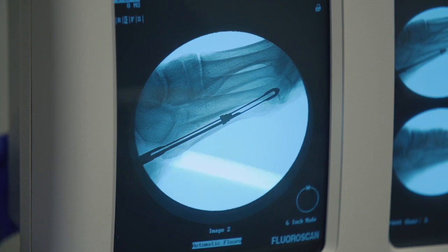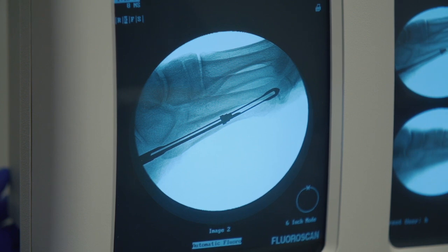Here, utilizing the new targeting guide through Stryker's Asinus system, you'll see on this lateral projection that you have three steps that signify medullary canal widths of 4, 5, and 6 millimeters. This particular patient is probably best suited for a 5 millimeter screw based on the sizing guide.